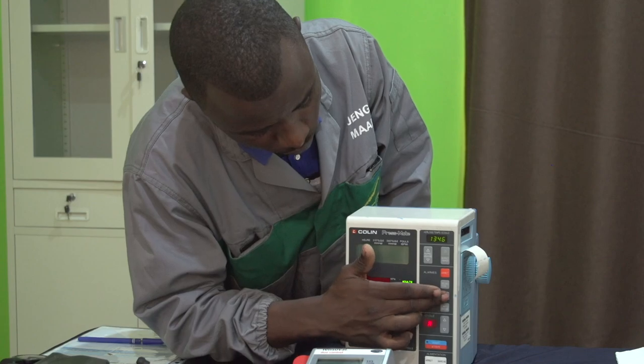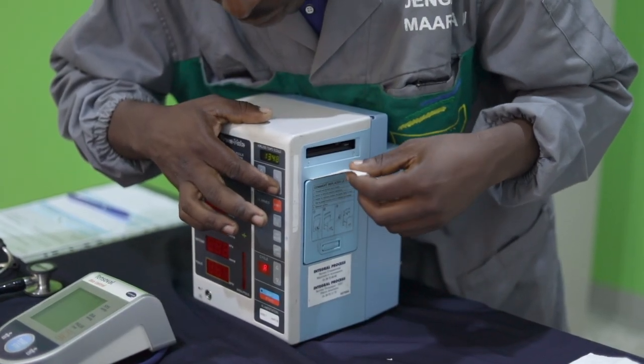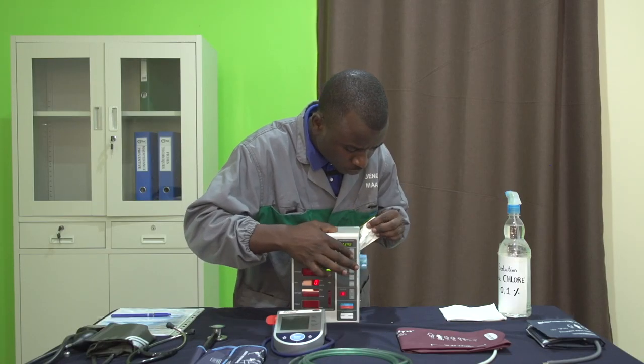Si le ventilateur est sale, on peut le nettoyer ou le remplacer. Si notre appareil est muni d'une imprimante, on va faire un test d'impression et vérifier qu'il reste suffisamment de papier.